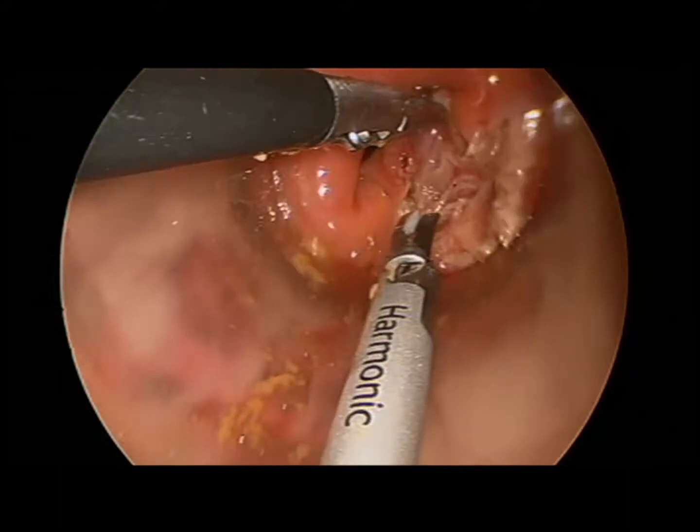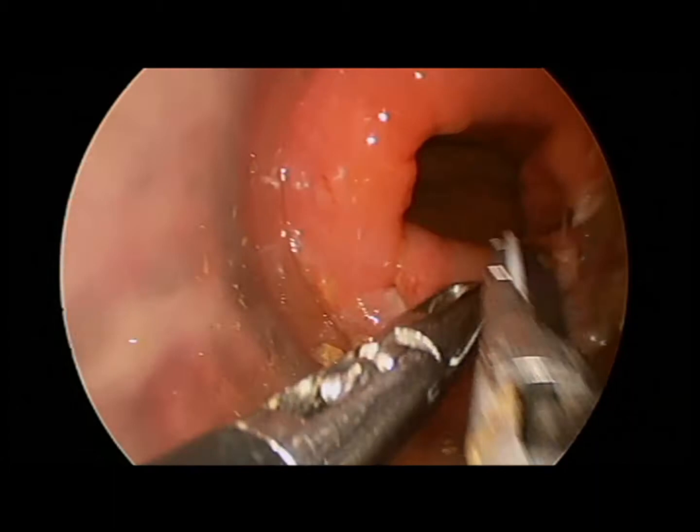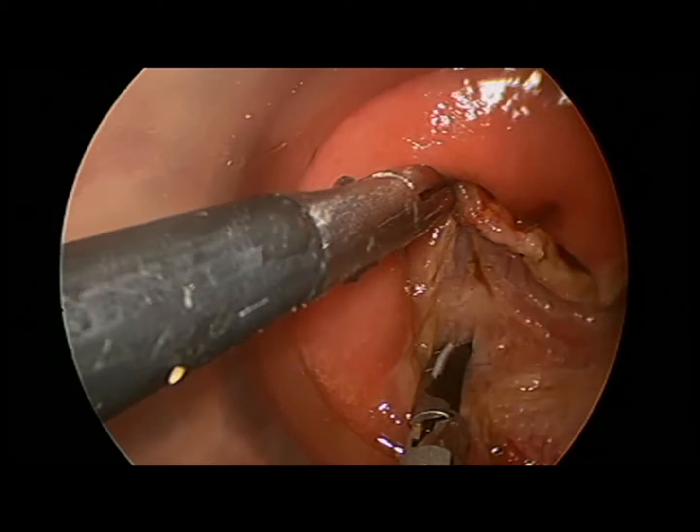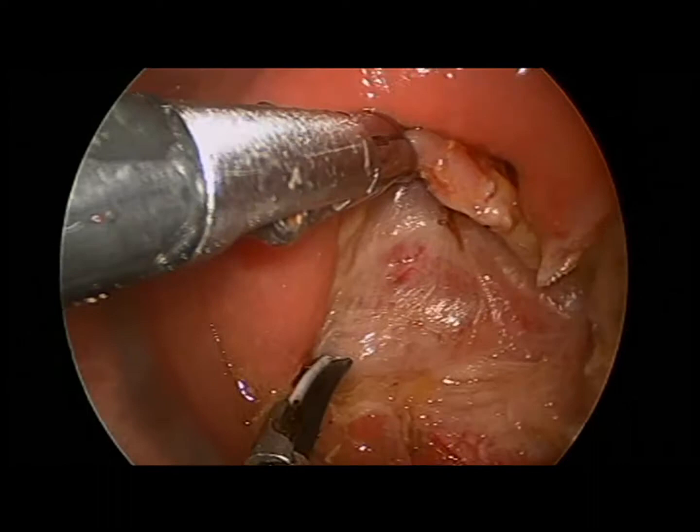The dissection was performed using ultrasonic energy with a harmonic device. The mucosa and submucosa were incised, but the lesion was intrinsically attached to the muscularis propria of the rectum and adhered to the levator ani muscle. Therefore, it was not easily detected initially.